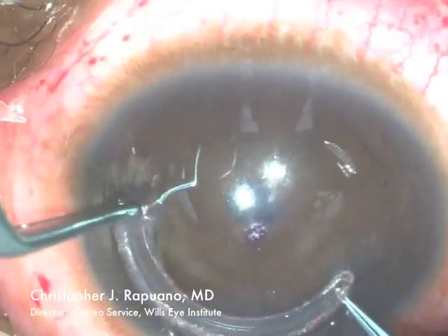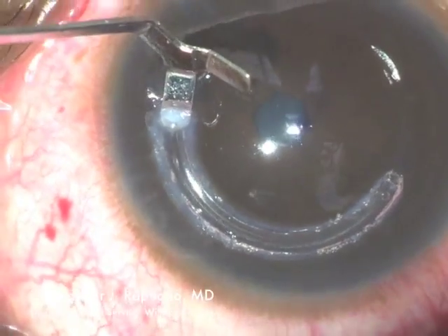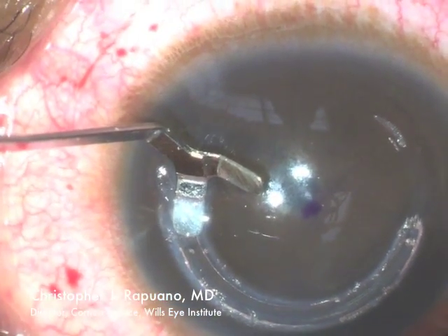Sometimes a second instrument is used to push the end down. The near end is then pushed in a little bit further so it doesn't sit right next to the wound.